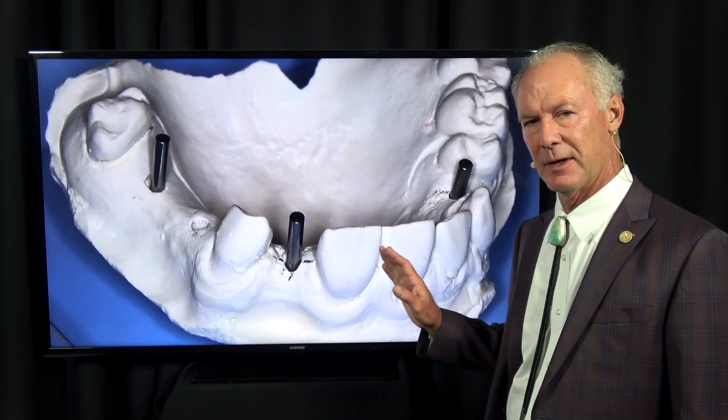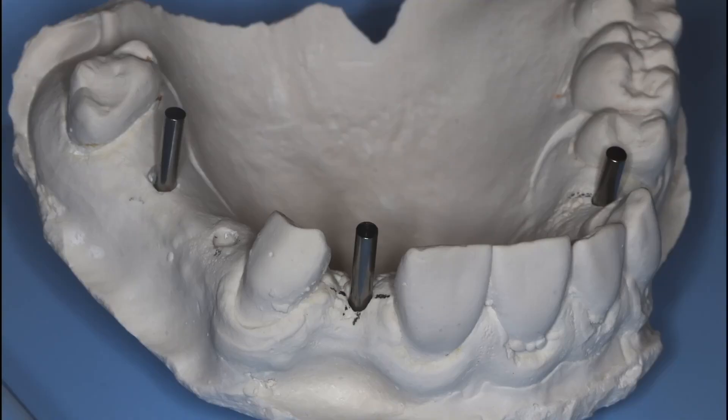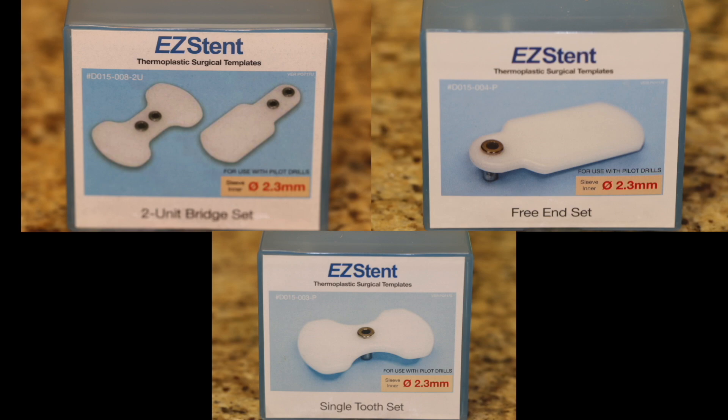This video is on how to fabricate a very simple dental implant surgical guide called the Easy Stent. You can see we've got an implant here, and we're going to place an implant here. This is the Easy Stent package.